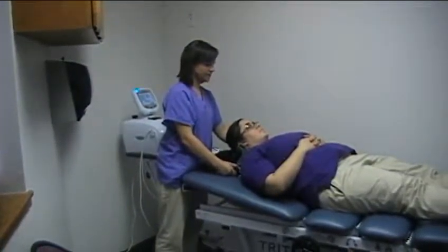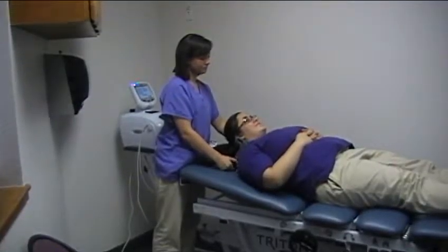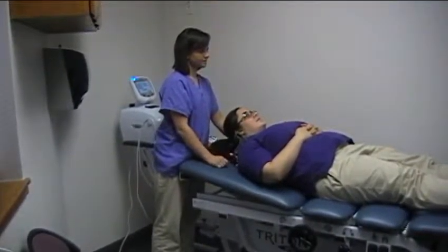Let the patient know: tell me when it starts to feel pretty tight, almost too unbearable. Then back off to a level that's still snug but comfortable.